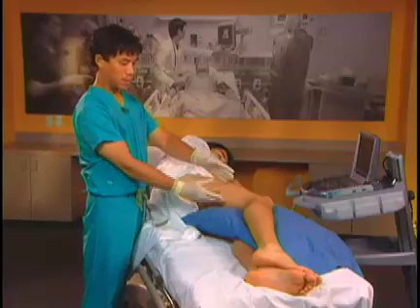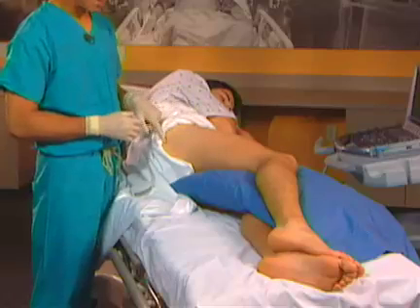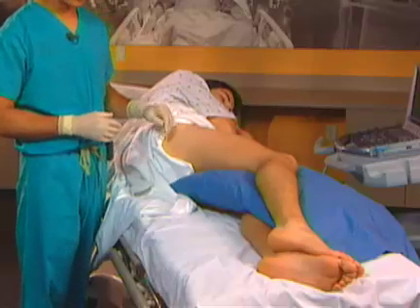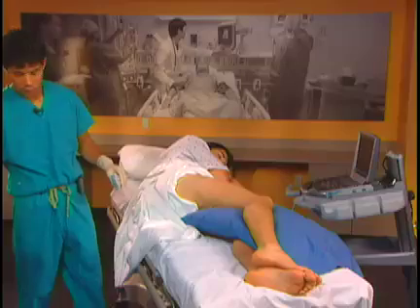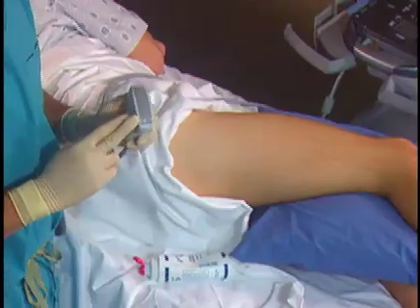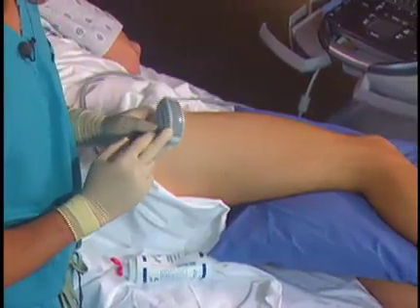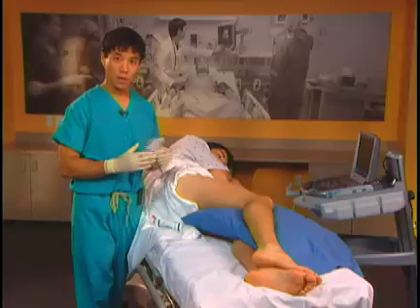This way you can cover any kind of pain of incision in the upper thigh area. To position patients for the subgluteal sciatic nerve block, we position the patient lateral. This way the patient is comfortable, they can be well sedated, and you can place the probe on the posterior side of the leg and advance the needle from lateral to medial. The probe we use is a curvilinear low frequency probe, because it penetrates deeper, which is useful in larger patients.